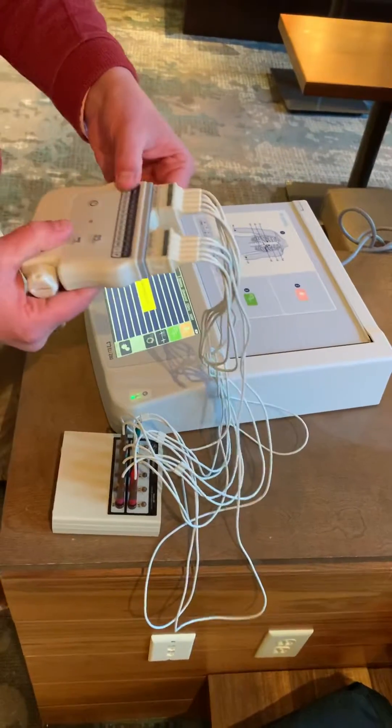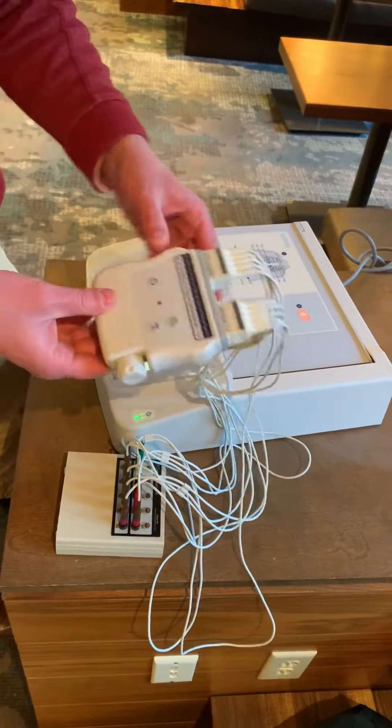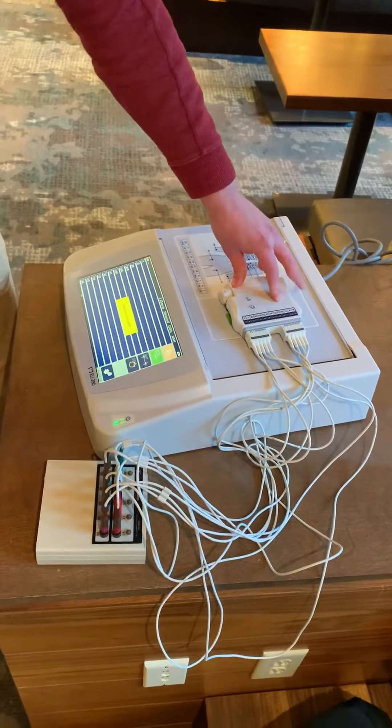First, if you have the WAM — the wireless acquisition module — you're going to want to make sure that it is paired with your box. To do that, place the WAM on top of the lid and turn it on.